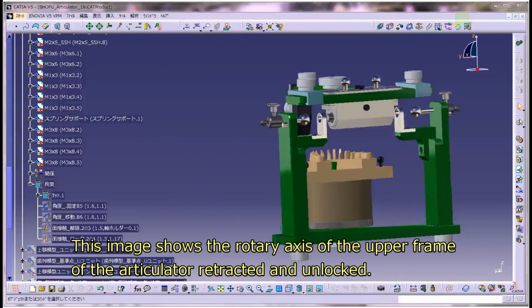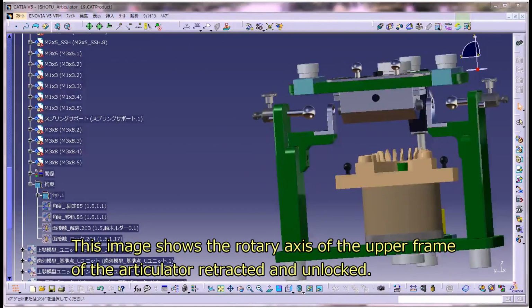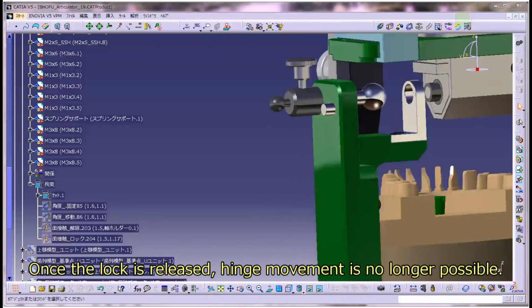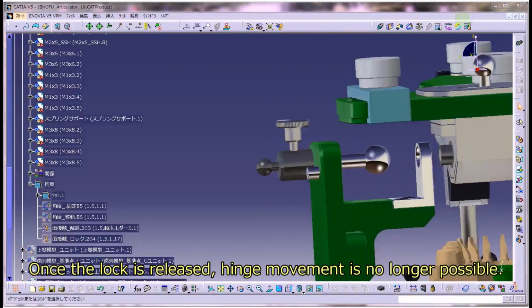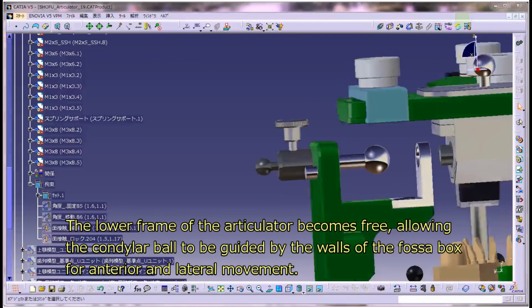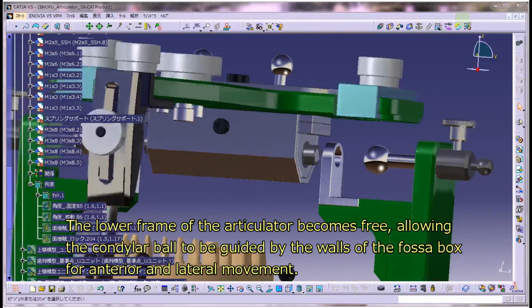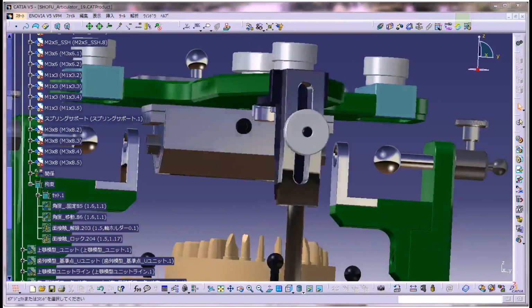This image shows the rotary axis of the upper frame of the articulator retracted and unlocked. Once the lock is released, hinge movement is no longer possible. The lower frame of the articulator becomes free, allowing the condylar ball to be guided by the walls of the fossa box for anterior and lateral movement. This is how it is structured.